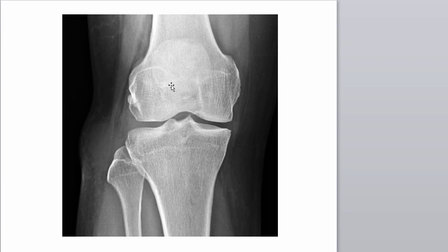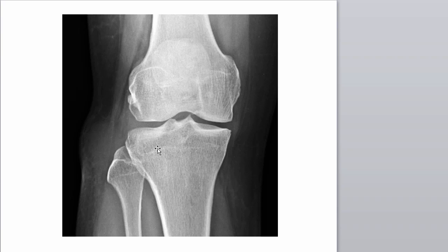Here's another one — I threw this in because now you can see the outline of the condyle. You can see the cortical bone right there — kind of like a chicken bone. This is the lateral, and this is the medial condyle of the femur. You can see nicely what's this region again — intercondylar eminence. Specifically this one is the medial intercondylar tubercle, and that one is the lateral intercondylar tubercle. That's a nice one — I could put a sticker right there. That's the adductor tubercle, where adductor magnus inserts. What are these lines? Those are epiphyseal lines — this is where there were growth plates, where you grow longitudinally. They're closed, so this person has stopped growing.